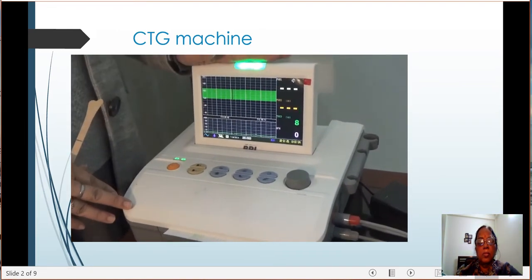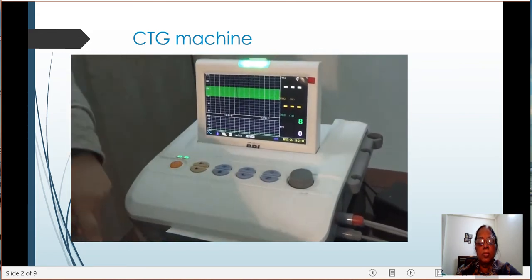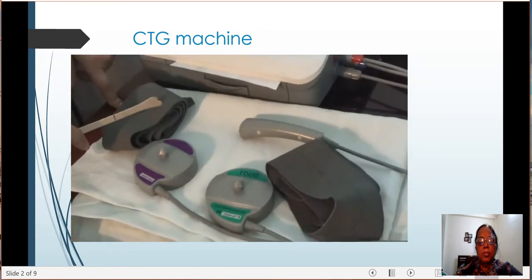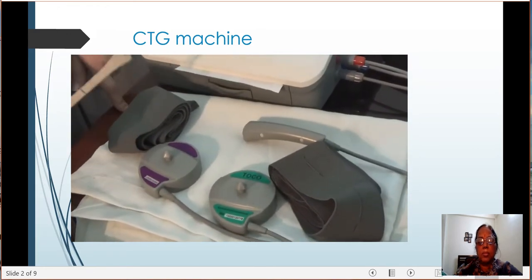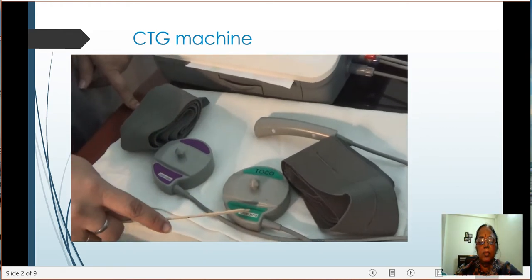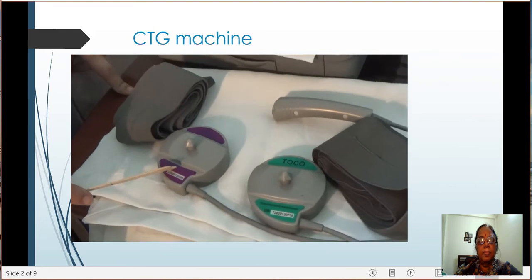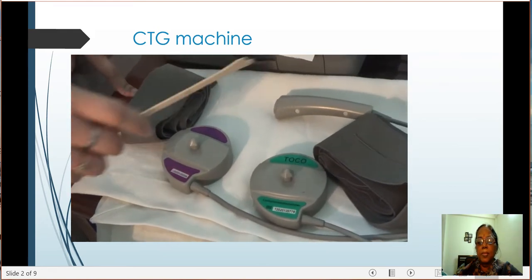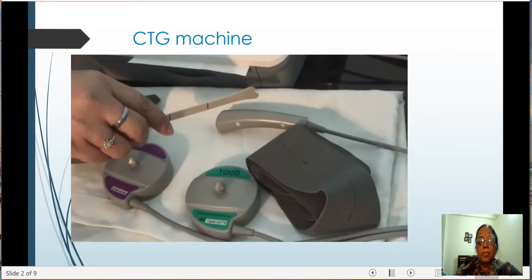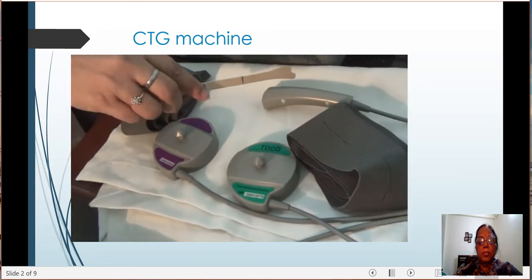This is a screen which is going to display our NST result, and these are the abdominal belts which will help to apply the transducers. We have two different transducers. One is a tocoprobe, which is marked by a green color, and this is the USG transducer that will record the fetal heart rate. This is the fetal movement counter, which is used to display the fetal movements and is present in the patient's hand.